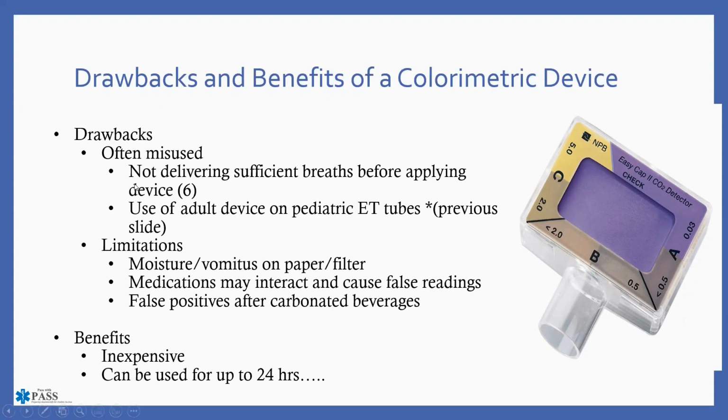So the device manufacturer, what they want you to do is before you put the cap on your tube, they want you to intubate and then ventilate, or at least ventilate your patient a minimum of 6 times, giving good tidal volume breaths before you apply the cap. The use of the adult device on the pediatric tube that we discussed on the previous slide, that is very, very important as well. Limitation: moisture and vomitus on the paper of the filter. Some medications can interact with that.